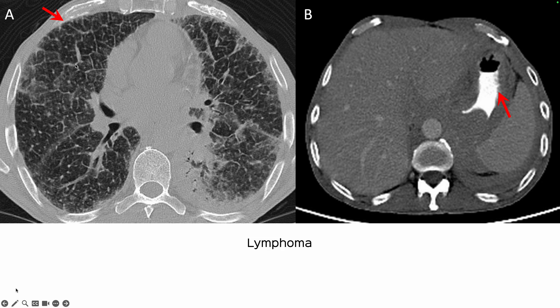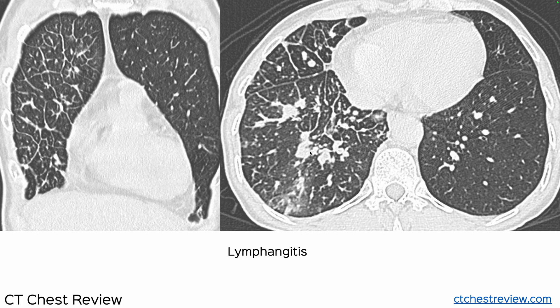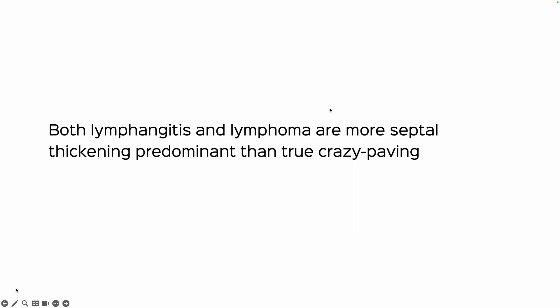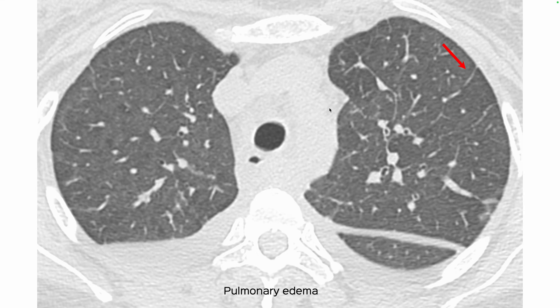This is a patient with lymphoma showing crazy paving with septal thickening and ground glass. There was pleural involvement and gastric involvement on the same CT, which allowed us to suggest the diagnosis — later proven on biopsy. Lymphangitis typically presents with septal thickening and rarely has a true crazy paving appearance, so both lymphoma and lymphangitis are more septal-thickening predominant.